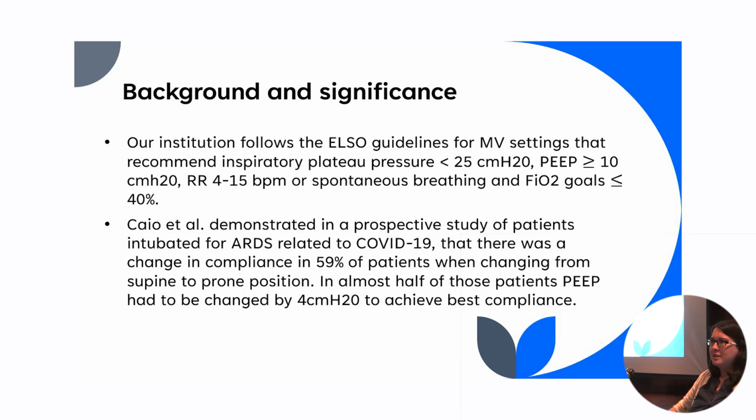As the earlier talk discussed about what those vent settings look like, I just tell everybody, hey, pressure control of 10, rate of 10, PEEP of 10, hopefully get us down to 40%, and then we're going to figure out the nitty gritty, and that's what EIT comes in and does with us.